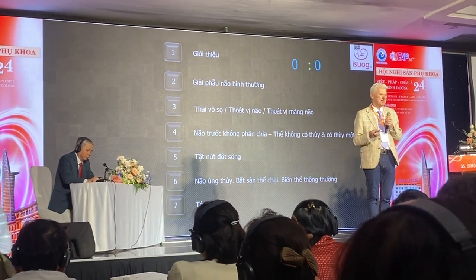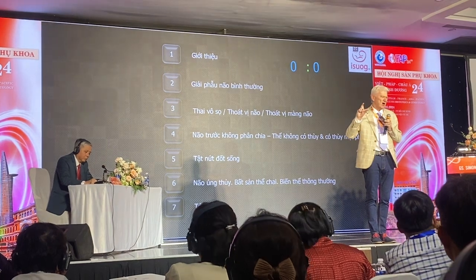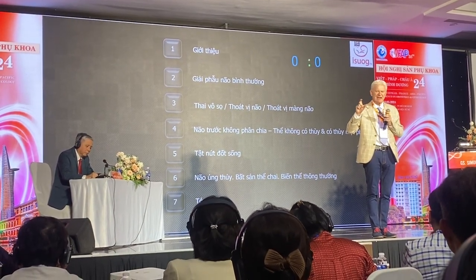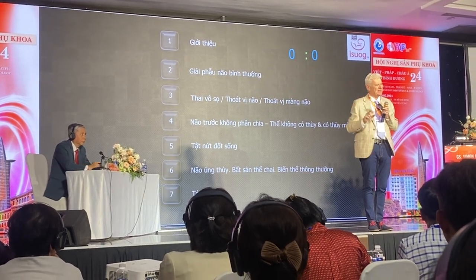Before, everybody would say, oh, the baby's too small. It's smaller than a credit card. A credit card measures 86 millimeters. When you're doing a scan at 13 weeks, it's less than that. That's the size of a fetus at 13 weeks.